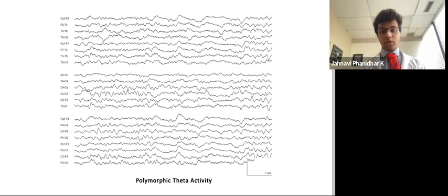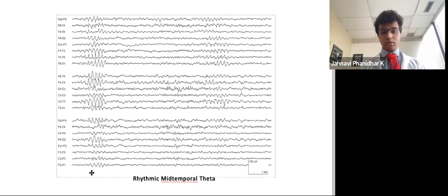This is called the polymorphic theta activity, in which the amplitude and the frequency will have an overall asymmetry, and it is diffuse. It is present normally in infants, but in adults, it can be normal drowsiness or even encephalopathy. It is for non-specific encephalopathy, which can be reversible or irreversible. Reversible causes are hypothermia, metabolic disease, or sedatives, and irreversible being any severe encephalopathy like infarction, tumor.